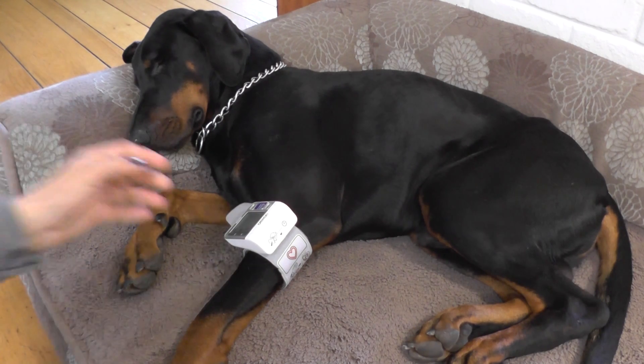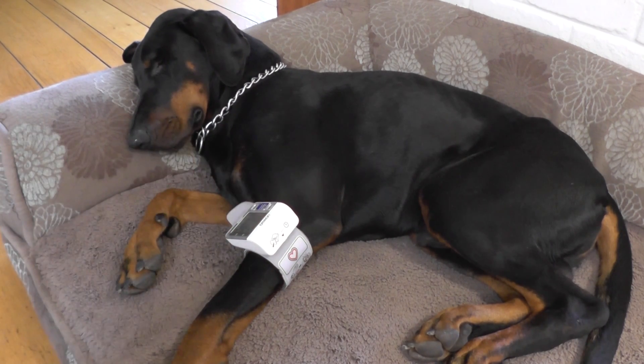If you wonder how accurate the results are, in my experience I took my dogs to a vet clinic where they measured their blood pressure with a Doppler monitor — a specific monitor for dogs for vet purposes — and the results were exactly the same as I got on this monitor.